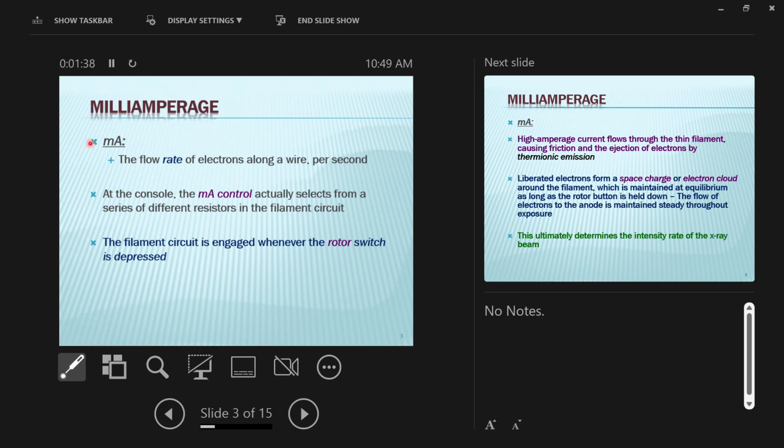Inside the equipment, using electricity to produce X-rays, you need to send some electrons across a gap in space, and you smash them into some target, right? We talked about that process. But just very simply, if you're talking about electricity in general, not necessarily in the X-ray tube, amperage is a number telling you how much electricity is flowing through a wire, okay? Milliamperage is that same thing. It's just a smaller number. Milli is the prefix meaning 1/1000th of something, okay?